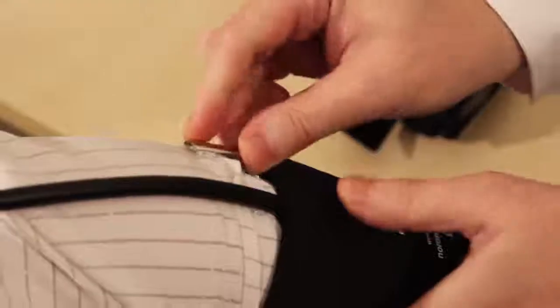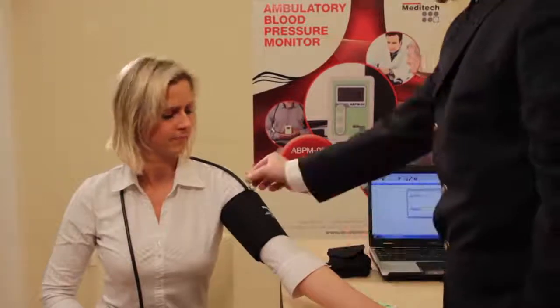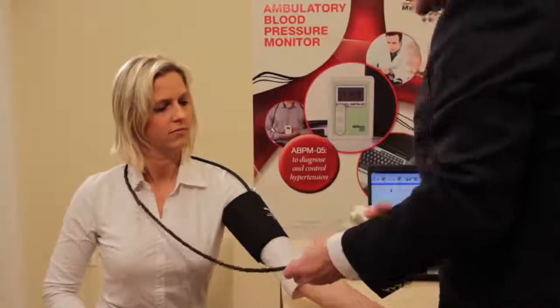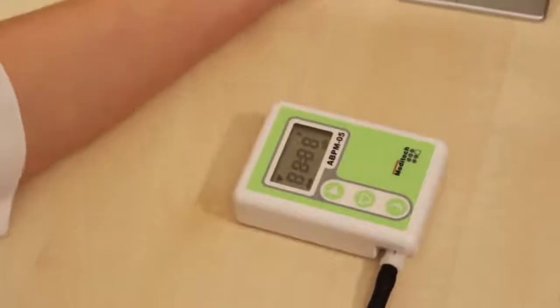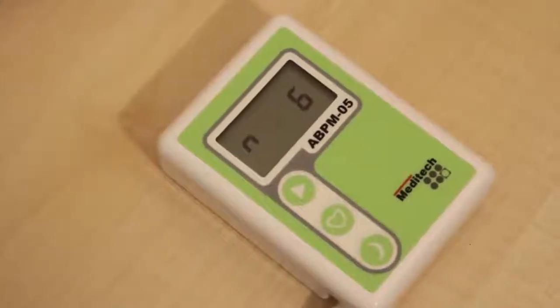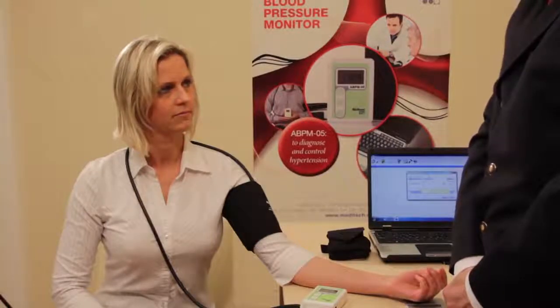With this little clip, you can fasten the cuff to the upper arm to prevent sliding. Once the cuff is applied, with the tubing leading upwards from the non-dominant arm and around the neck, you can connect the device to the cuff as before and start a manual measurement just to check the initial blood pressure level of the patient. This will take approximately half a minute to a minute to complete, and then the device can be inserted in the holder pouch and applied to the patient's waist, and then the patient is ready to go.